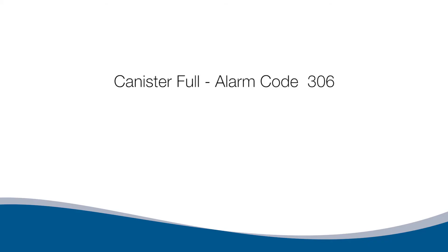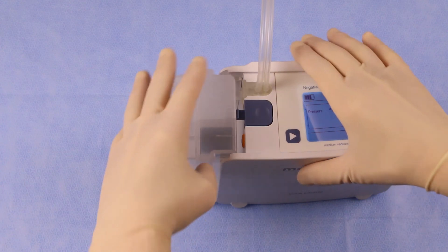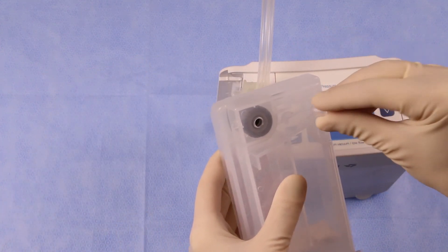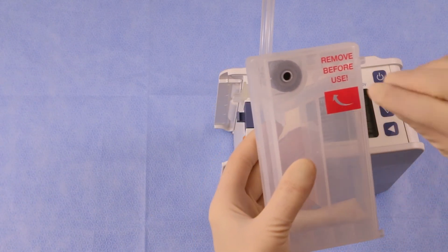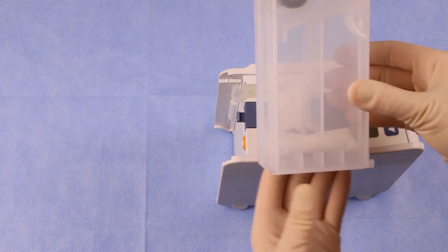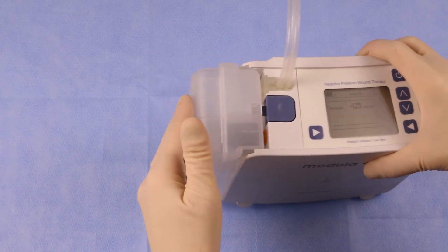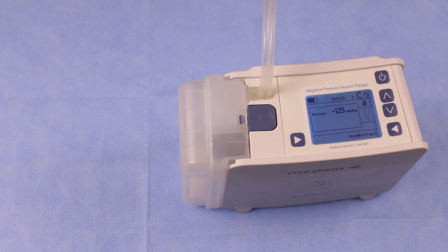Canister Full, Alarm 306: change the canister. Press standby for three seconds to stop the pump. Release and remove the full canister. Seal the used canister with the sealing cap located on the side of the canister. To insert the new canister, first remove the sticker that reads 'Remove before use.' Slip the pegs at the bottom of the canister into the slots at the base of the pump. Lift the canister towards the pump until an audible click is heard. Press ON to resume the pump and the motor will start running again.